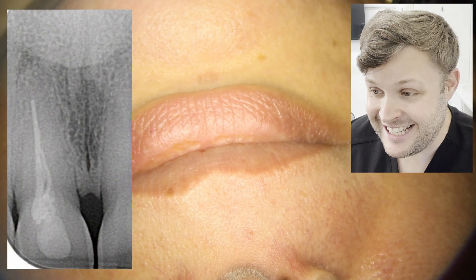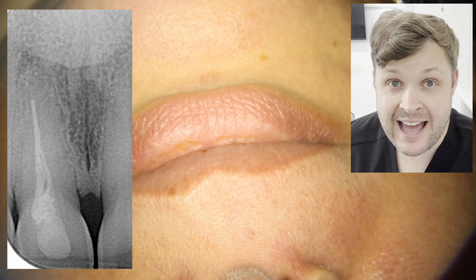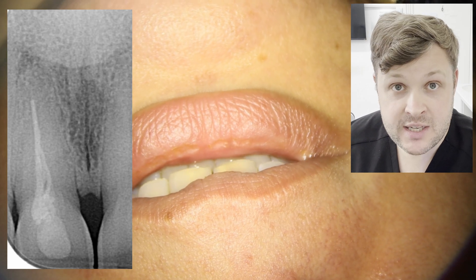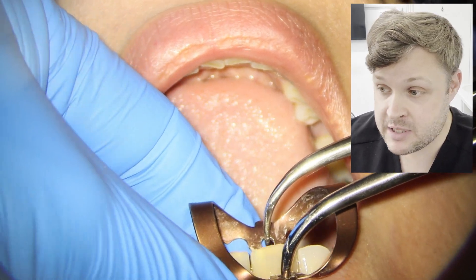Hello, welcome today. This is a great little video demonstrating how to do a re-route treatment. I've noticed on a lot of my metrics that a lot of people are looking for re-route treatments and how to do it.